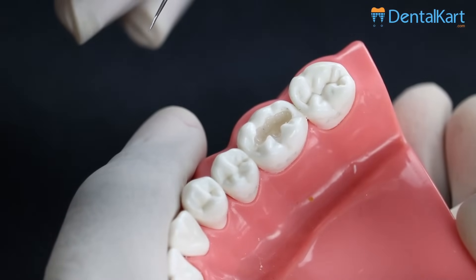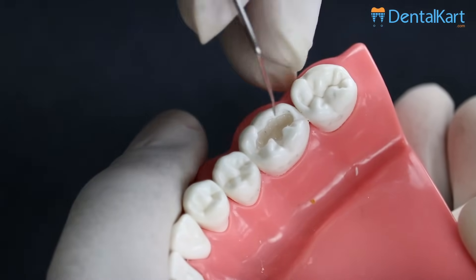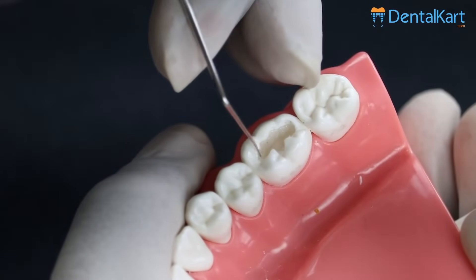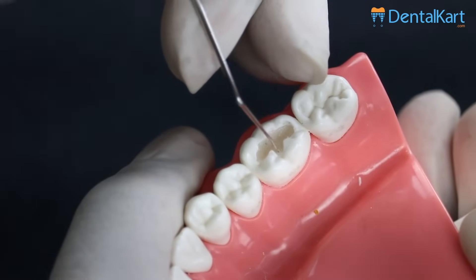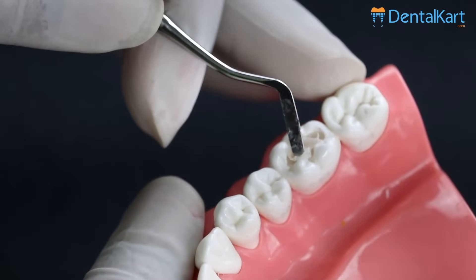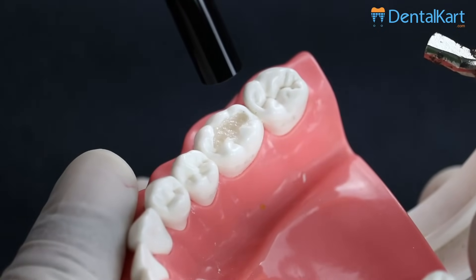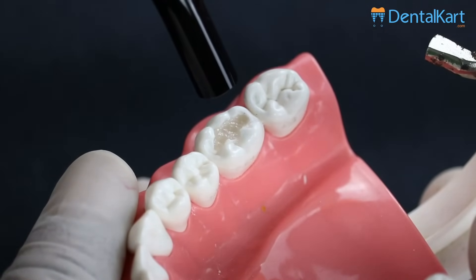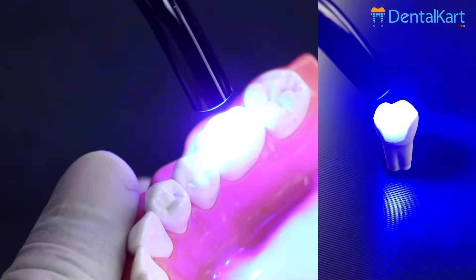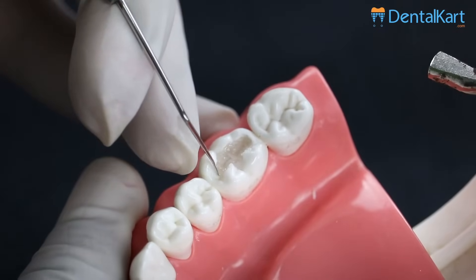Let's check that the LED curing light has cured this composite material well. You can hear the scratching sound — all the margins have cured very perfectly. Let's place the final increment of this composite material to the restoration and cure it for 20 seconds. You can hear the scratching sound again — all the margins have cured very perfectly.